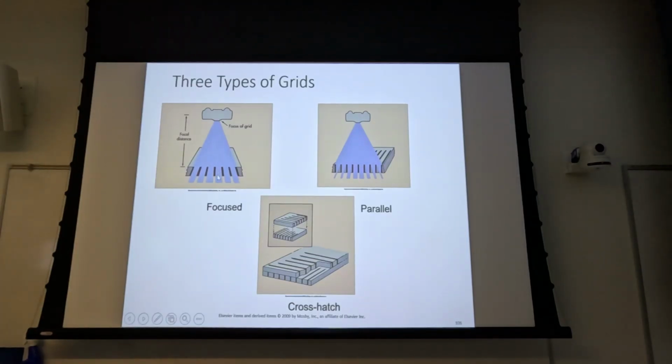Also with a focus grid, if you flip it over and you've got the image receptor side facing the tube, then the canting of the grid strips are going exactly opposite from the divergence of the central ray. So what you're going to get in that case is good density right in the middle, and then you get immediate significant grid cutoff. Okay?